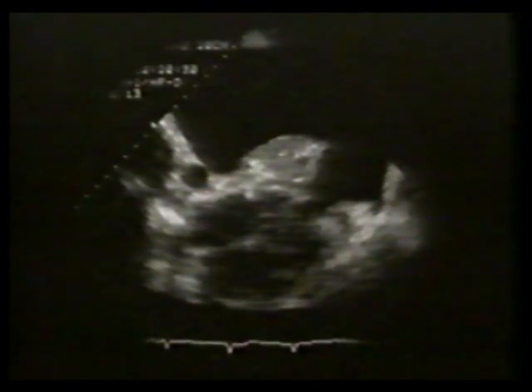Clumps or strands of fibrin are also commonly identified within pleural effusions. In addition, segments of atelectatic lung are frequently visualized. The heart is being imaged through this left pleural effusion with the transducer near the left scapula. This mass within the fluid is atelectatic lung.